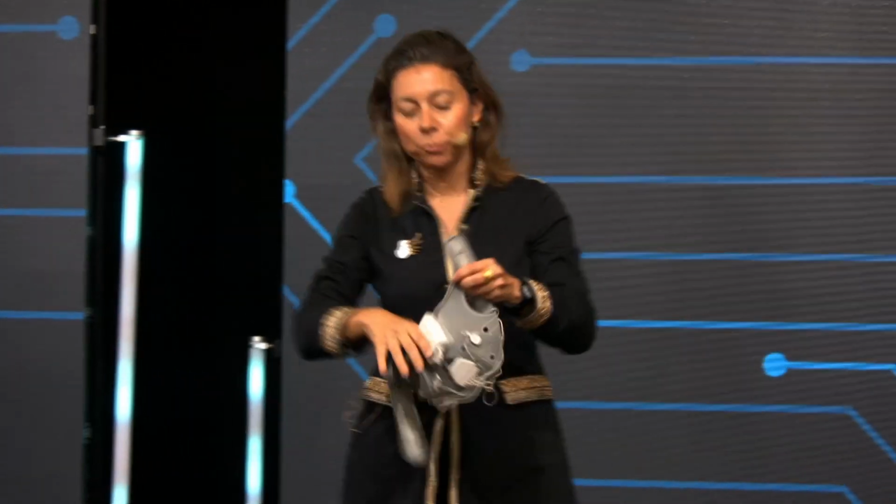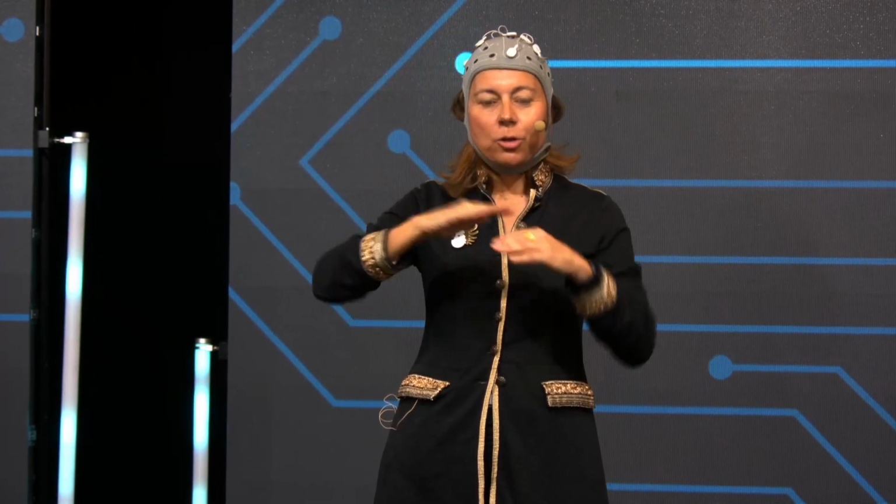So let me tell you how it works. When I wear the cap and I inject the current, which is maximum 2 milliamps, you feel like an itching because there is a change in voltage in your brain. So you feel an itching sensation. So to fake the sham, to all the patients, we give them 15 seconds of stimulation so that everybody has the sensation of the change in power. But then during the 20 minutes of stimulation, the sham arm doesn't have any stimulation. That's how we fake it.